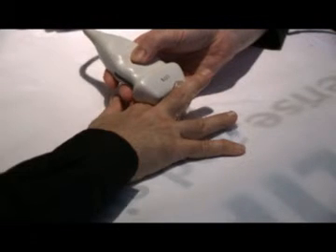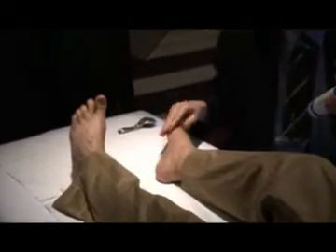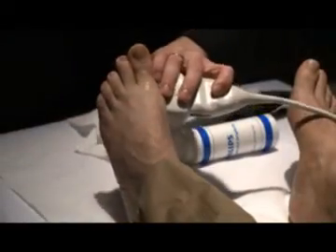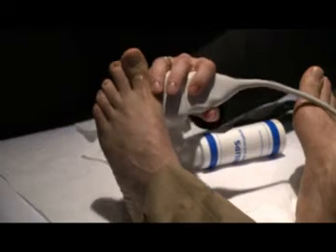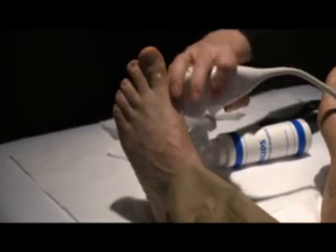Here you see a small erosion, so this is definitely abnormal. You see it's nicely flexible. He had some pain sometimes, but not a real gout attack. Now I go around, looks pretty nice, no double contour sign. However, if we come here, we see an erosion.